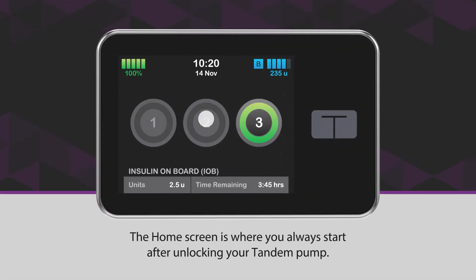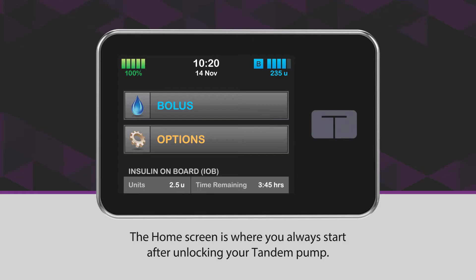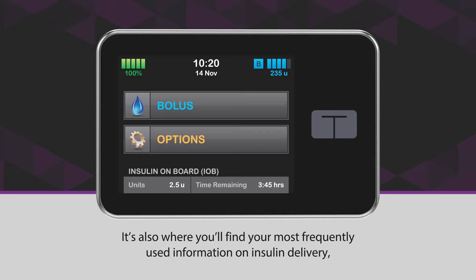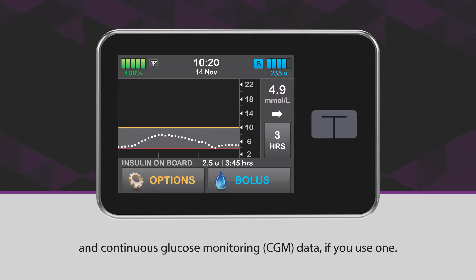The home screen is where you always start after unlocking your Tandem pump. It's also where you'll find your most frequently used information on insulin delivery and continuous glucose monitoring data, if you use one.